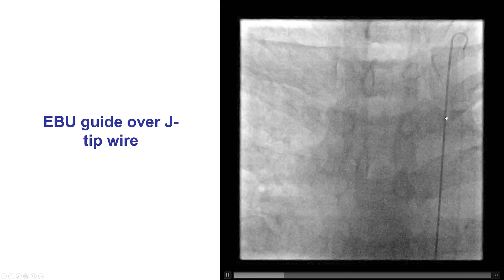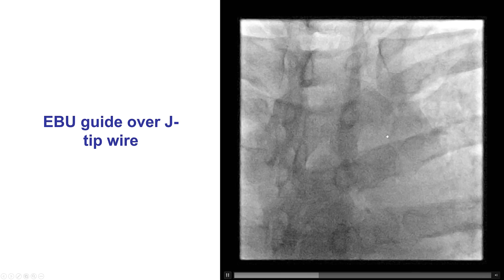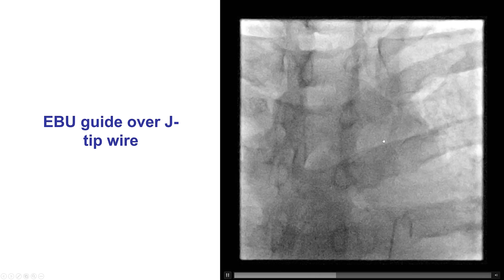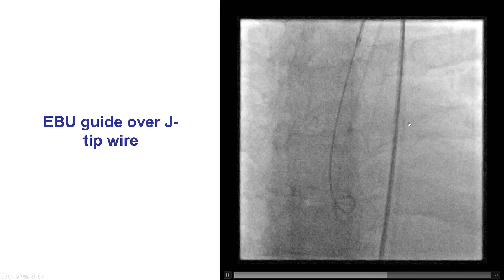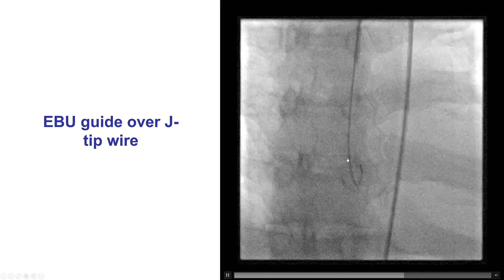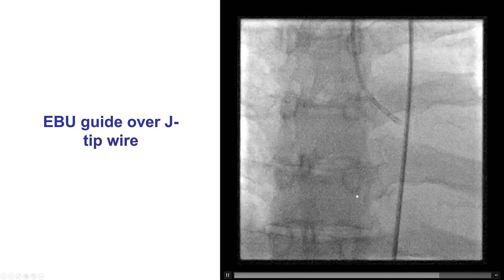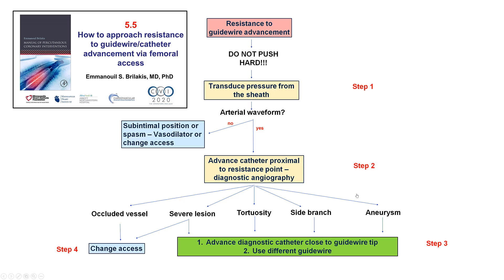Sometimes the guide wire may enter branches — for example, here it's going to the left subclavian artery. In such cases, the wire is pulled back and redirected into the ascending aorta. If there is resistance to guide wire advancement, this is described in detail in video 5.5, but the key concept is to not push hard.